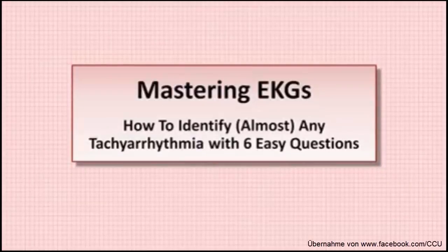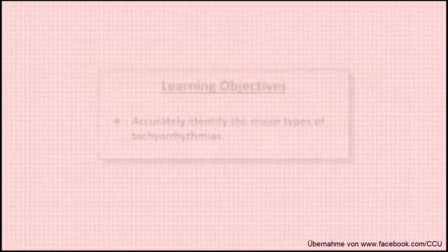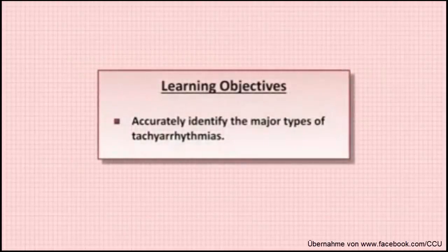Hello, this is Eric again, and today I'll be continuing the subset of videos on tachyarrhythmias with a discussion of how to identify almost any tachyarrhythmia with 6 easy questions. I say almost because there are a handful of uncommon rhythms which require a lot of background and training to accurately identify, such as the specific forms of supraventricular tachycardia. However, after this video, you should be able to identify the overwhelming majority of these arrhythmias.